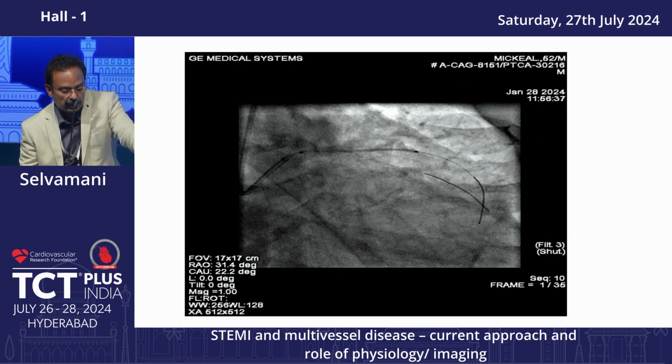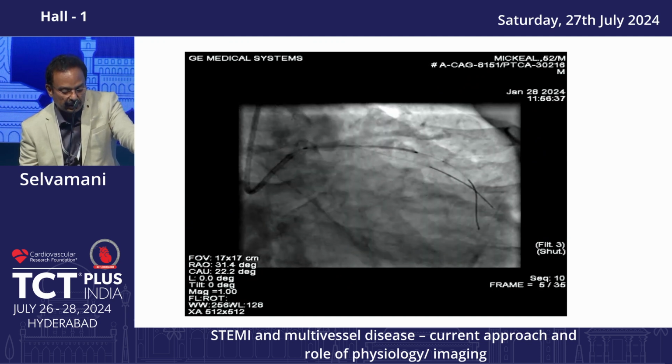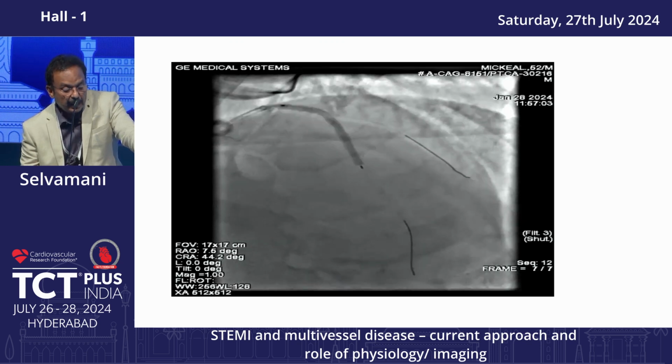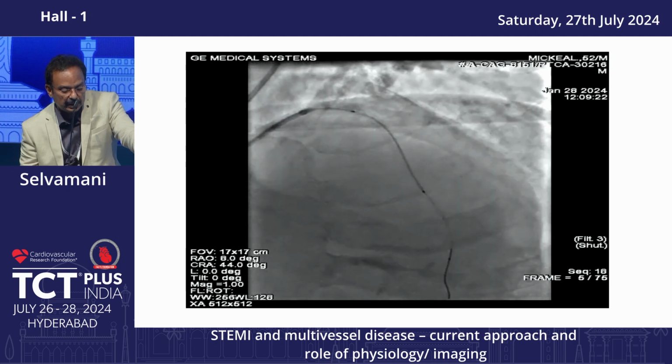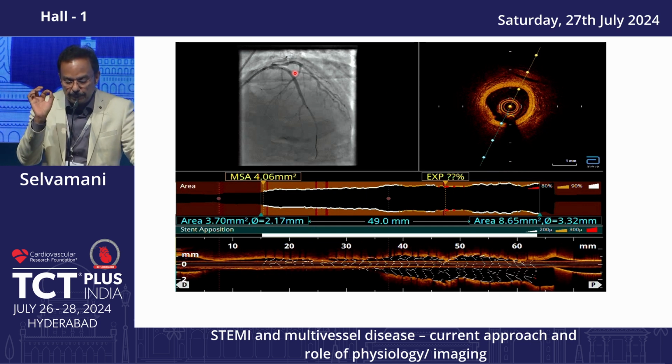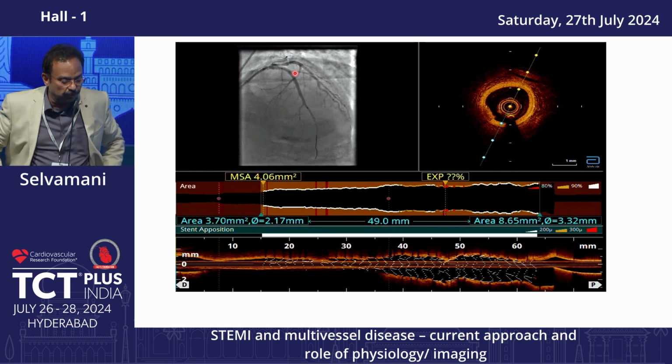And then once I prepare it, most of the time, if it is not a calcified lesion and you are satisfied with the preparation of the fibrotic area, you go with stenting there. And post-stenting also, imaging is very, very important. Most of the time, when you treat a lesion like this, we size it to the distal vessel. So post-dilatation is one of the places where you get slow flow.